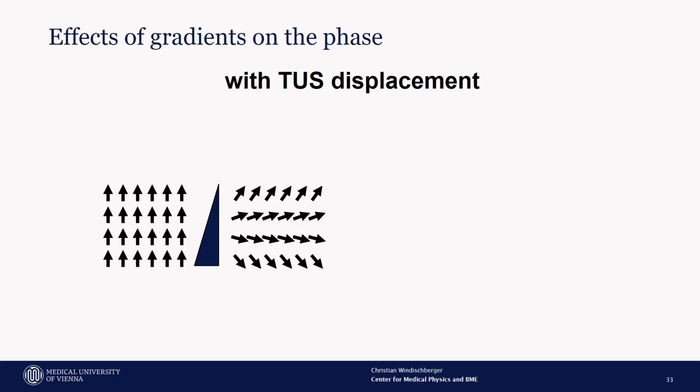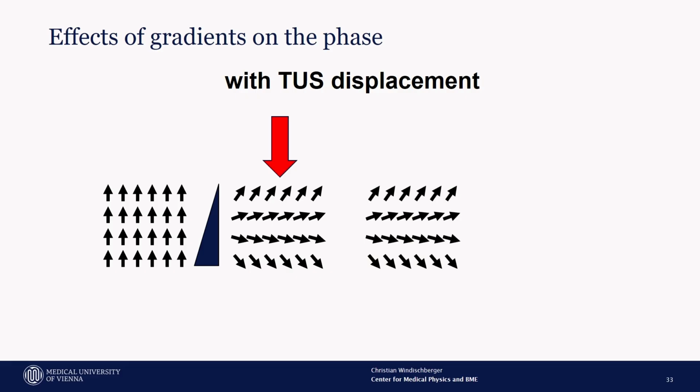So again, we have this dephasing effect in there, right? And now we're applying tFUS here, which means that these spins are now moved a slight amount, right? They are moved, the spatial position has changed.